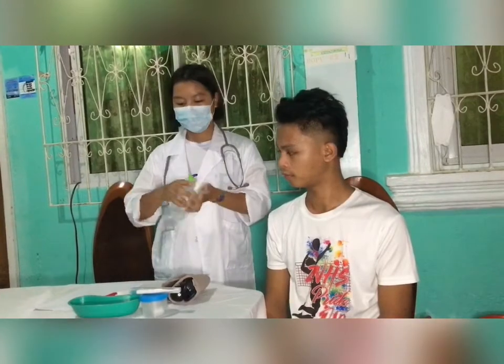Good day, ma'am. I am here to do the vital signs demonstration. First, you need to do hand washing or sanitize your hands using alcohol to prevent cross-contamination.